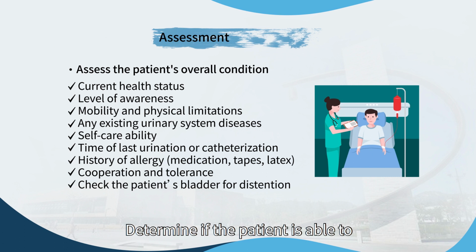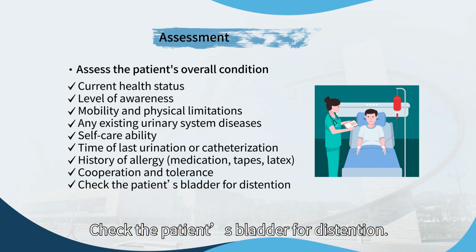Determine if the patient is able to cooperate with positioning and tolerate the procedure. Check the patient's bladder for distension.